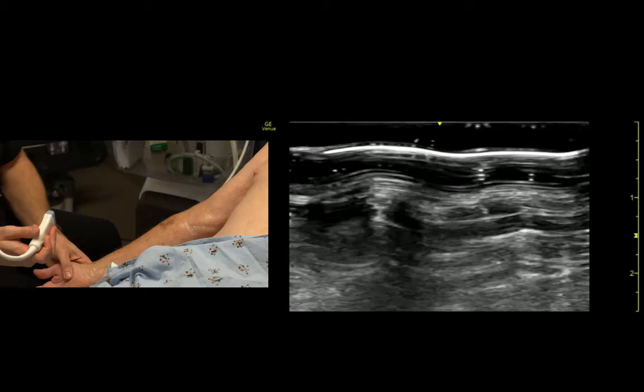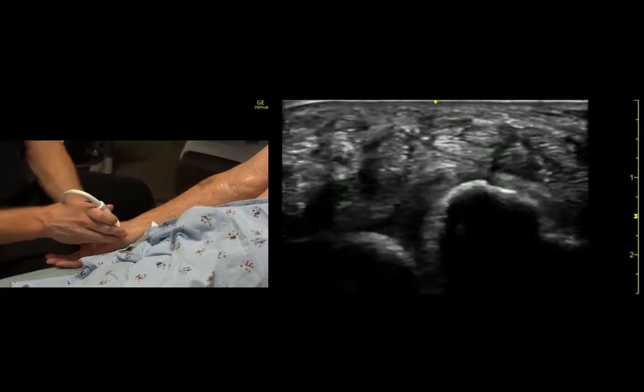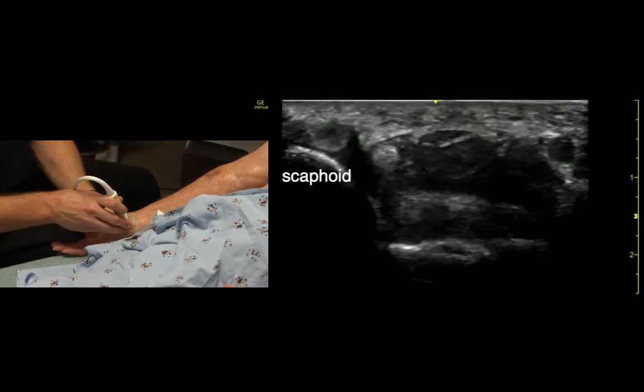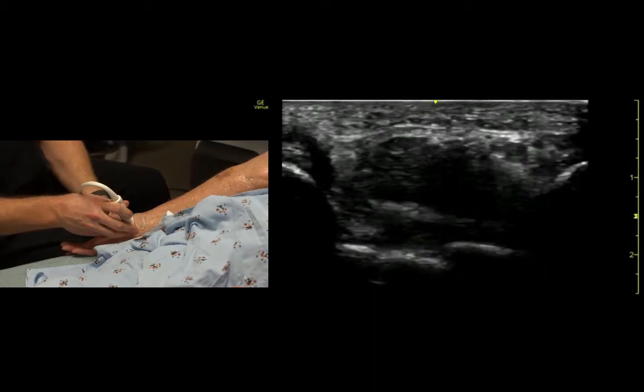The median nerve, which I like to find in the wrist. If we come down far enough in the wrist, again, the indicator is towards the patient's right. This is the scaphoid bone sticking up over here. The pisiform bone sticking up over here.